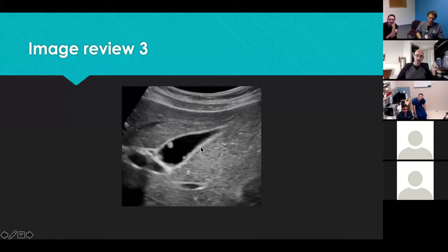So technically here, you are using your axial resolution. Therefore, it doesn't look that thick because it's more perpendicular to the ultrasound beam direction. But here, because of the way it's lying in comparison to the probe interface, it's much more oblique in relation to the beam direction.